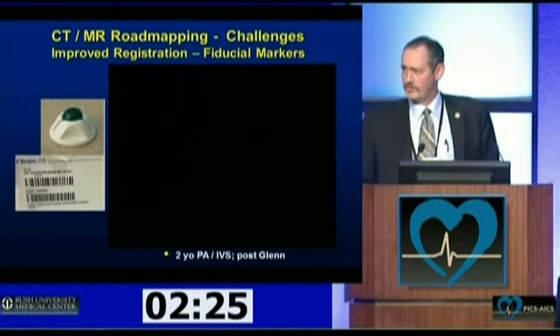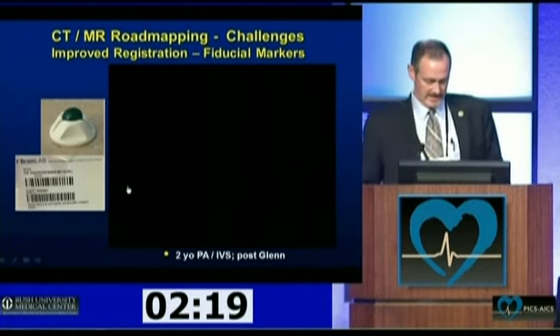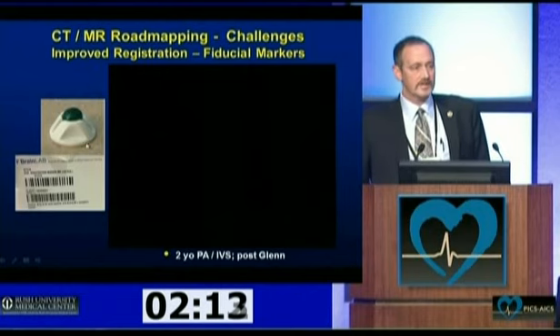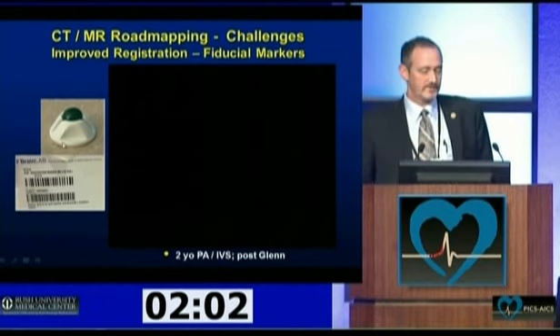Some of the challenges we've found already: again, I already mentioned our registration process. I think we can do a better job with this, and we're looking at different ways to do it. We've had several patients where we used fiducial markers. These are stickers that can go onto the patient's skin. They are used on patients that come in for an MRI and cath on the same day, so we can place them on the skin where they'd be in a good place for the MR and also out of the way for fluoroscopy.